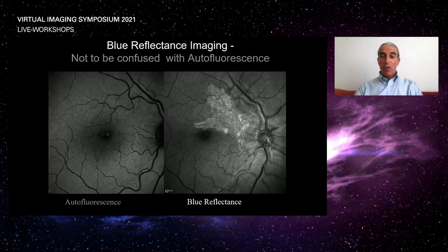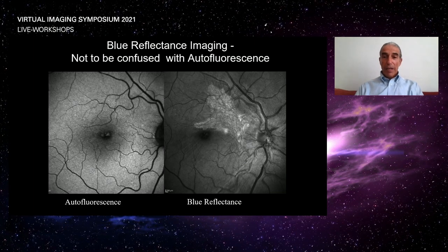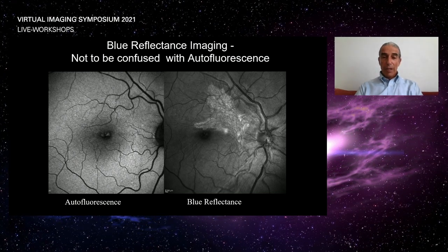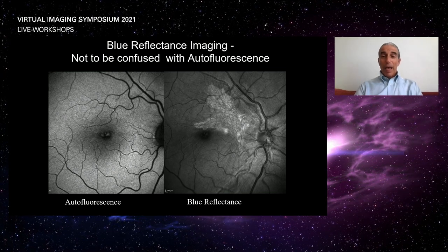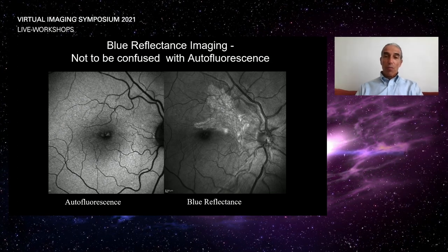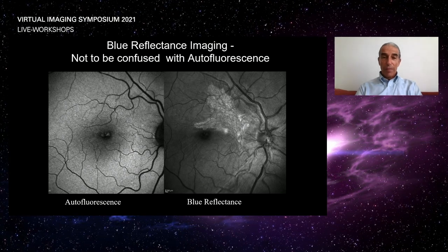Let's not forget, though, as dramatic as it is, that it's not autofluorescence. And that's our second non-invasive imaging modality. This is the same patient, same setting, same lens, if you will. But as we know, the focal plane is essential. The image on the right, blue reflectance, shows us a dramatic epiretinal membrane.